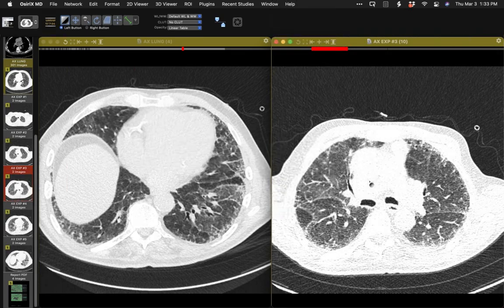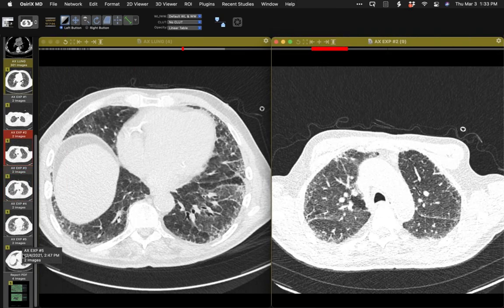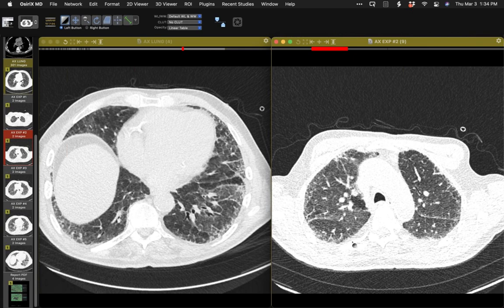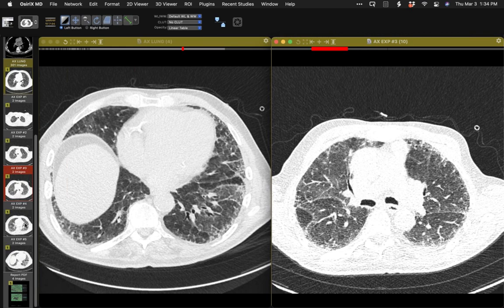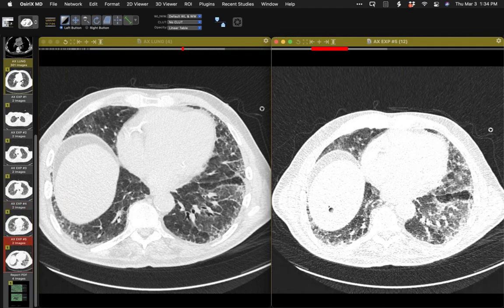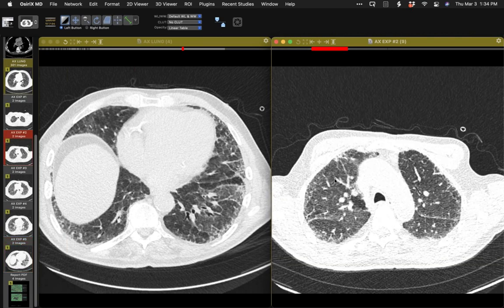Upper lobe on both sides and lower lobe — three lobes — that was the criteria we used in drug studies for scoring sufficient air trapping. I would say this is not IPF. There are just a few areas of air trapping, but it's not a dominant finding at all. Do you have path on it? Yes.